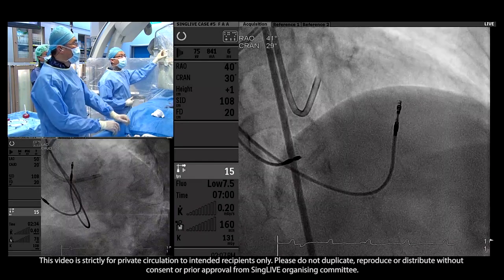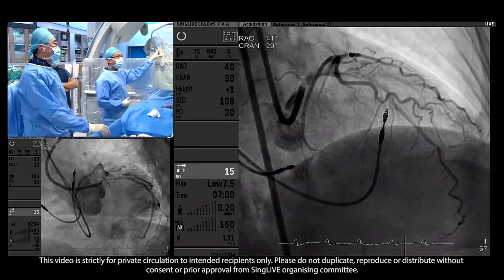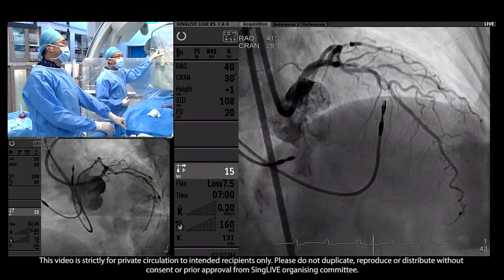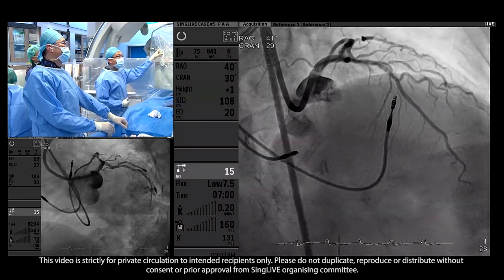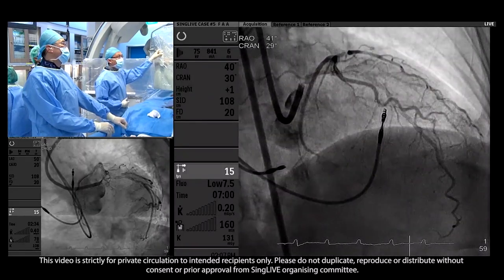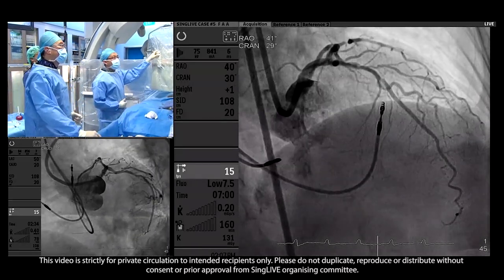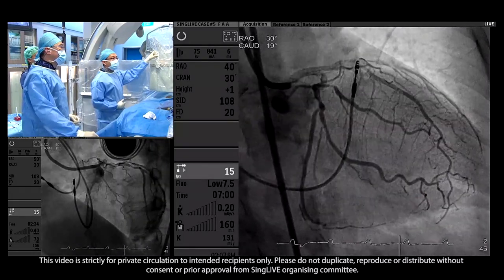The angiogram that we have done today is largely similar to what we have. You can see that the LAD is diffusely diseased. There's calcium, and this chunk of calcium in the proximal LAD made wiring a little bit difficult. I had to switch out a Sion Blue for a Fielder wire to eventually wire the LAD. This is the circumflex, which we know.